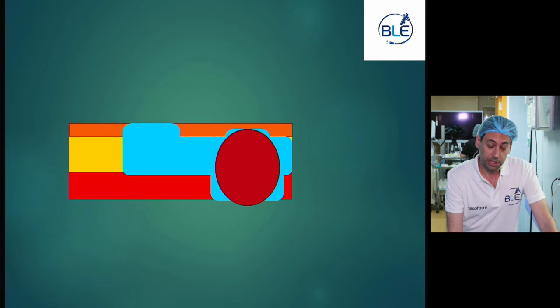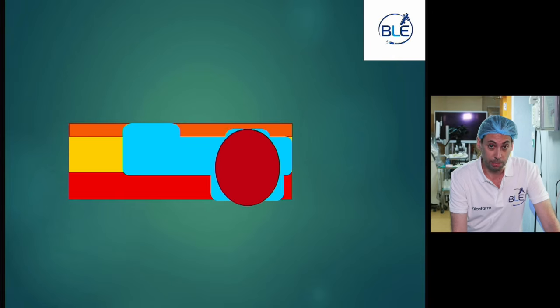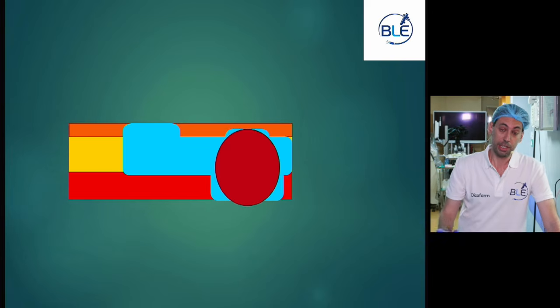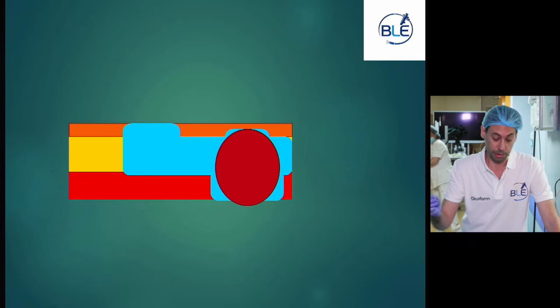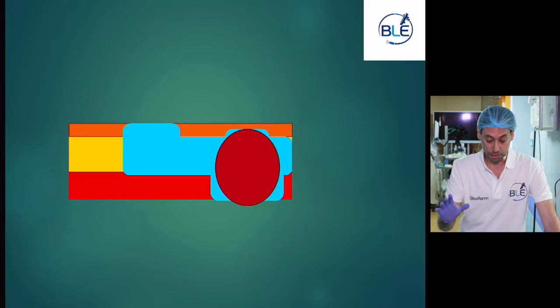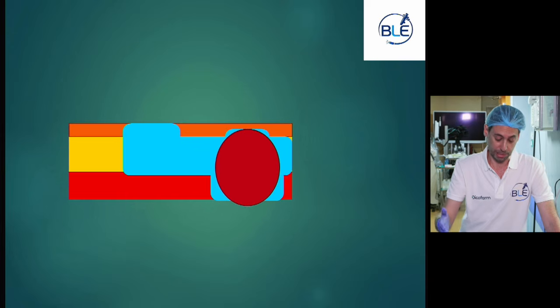Then, if the lesion is strongly attached, originates from the muscle layer and penetrates the muscle layer, we'll have to do perforation. At this step, in case of capnoperitoneum, we have a syringe filled with normal saline and we are ready to puncture the abdomen in order to decompress it and not make the ventilation of the patient difficult.